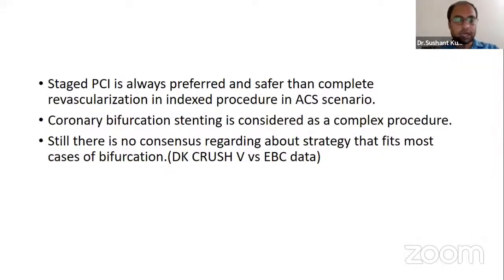Regarding coronary bifurcation, of course, stenting is considered a complex procedure. Still, there is no consensus regarding the strategy that fits most, because there is a dilemma about whether to do a dedicated bifurcation strategy versus provisional. Most operators prefer provisional over dedicated unless required, in an ACS scenario.